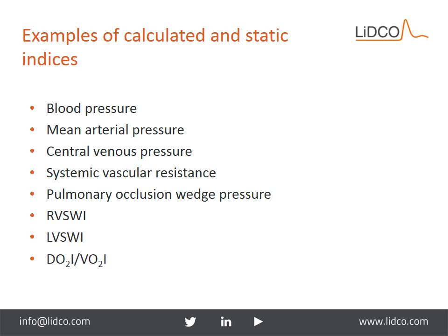Is it representative of our patient? And we need to scrutinize these things at the bedside, especially if the numbers and the data do not match our clinical picture. Data is only as good as accurate as it is, or valid as it is. And so consider these things at the bedside when you are doing your patient care.